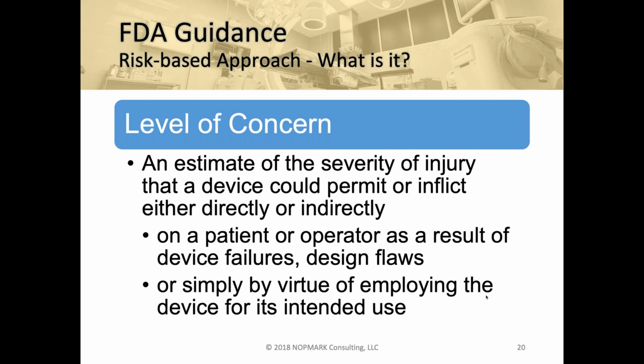It can be just by how the software is being used. And that's the aspect of validation: sometimes the customer will use the software differently than maybe we intended or expected. Just by their normal use, but in a different fashion where they're interpreting data wrong or entering data wrong, they themselves may be making a mistake, and through that use error, it can actually lead to harm.